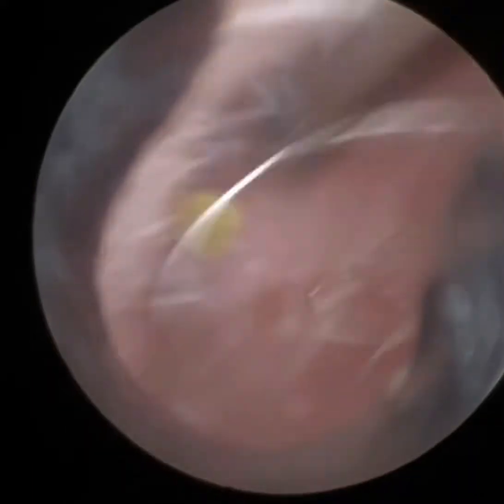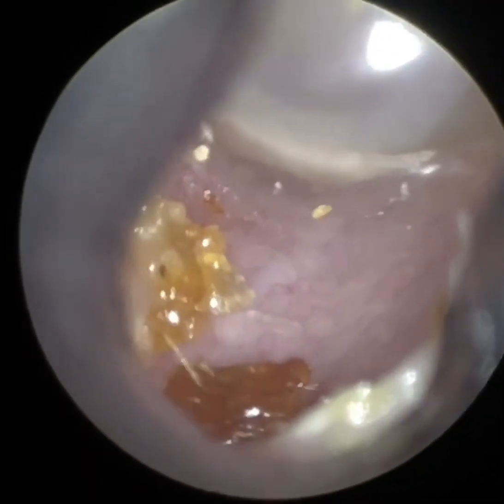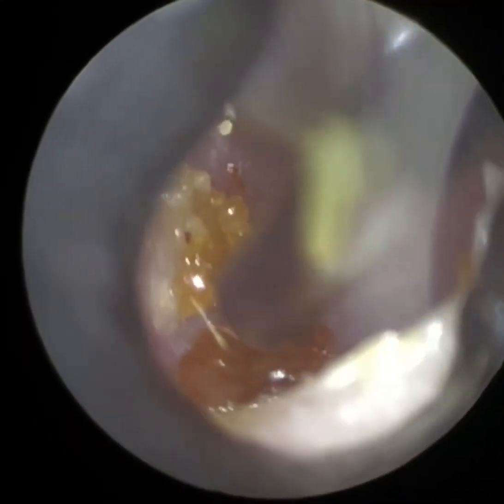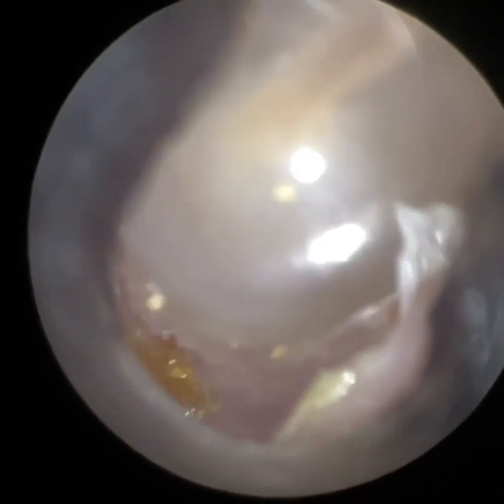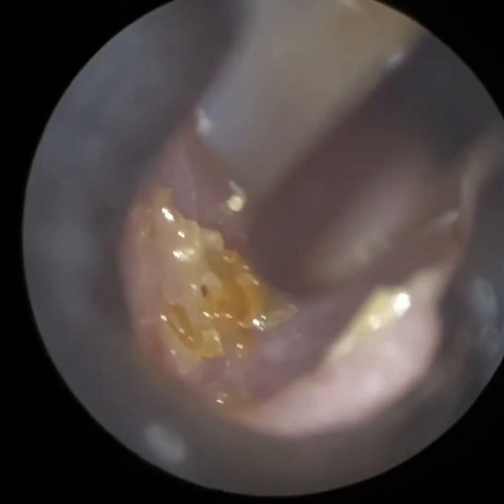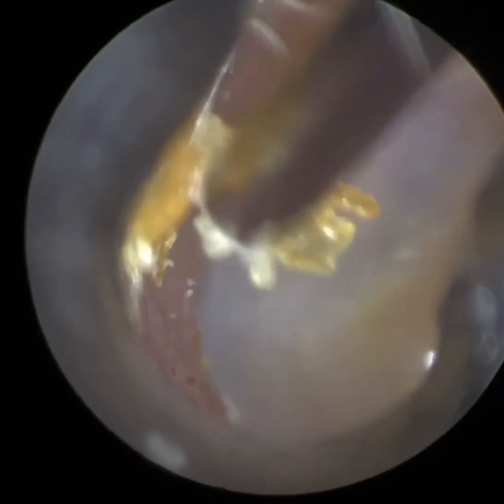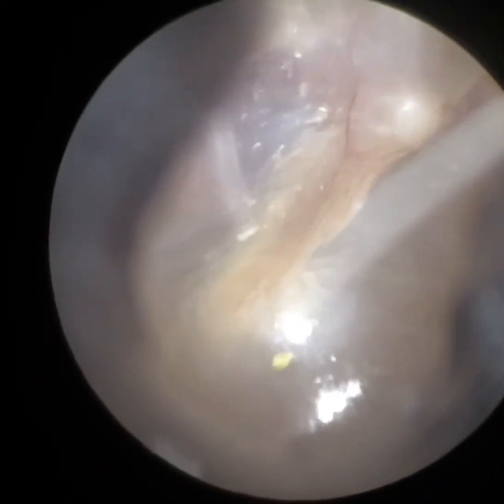This is some dry skin just at the base of the ear canal that we're removing — in the inferior aspect, only more mid canal. It's quite tedious this last bit, but it's well worth removing. You may have seen that just as I went into the ear, just on the outside, the patient had been scratching the ear because of the itchiness caused by all this dead skin. Just having one last view of the patient's eardrum.